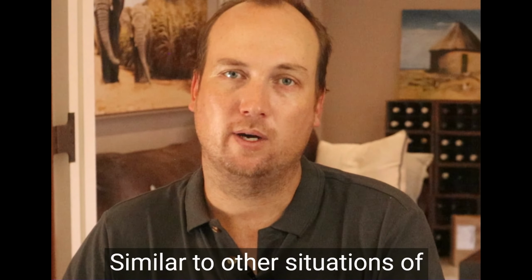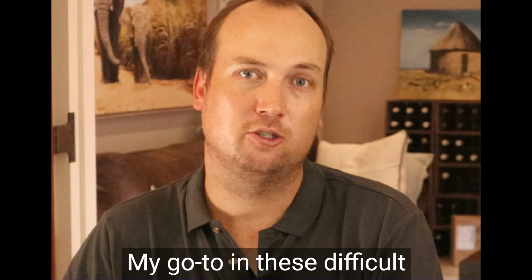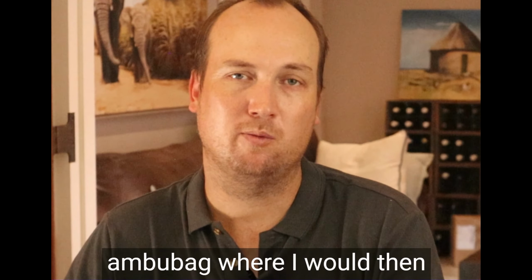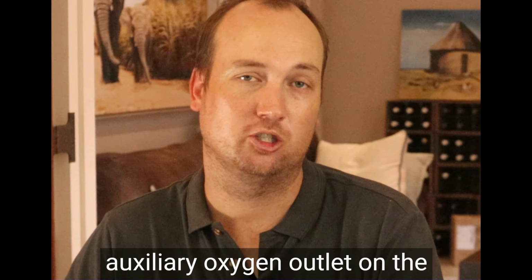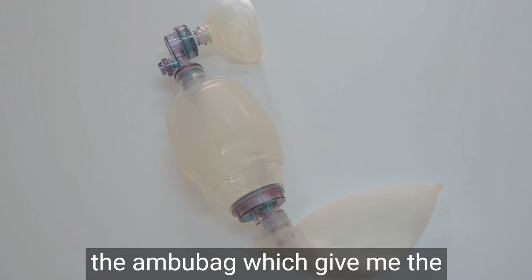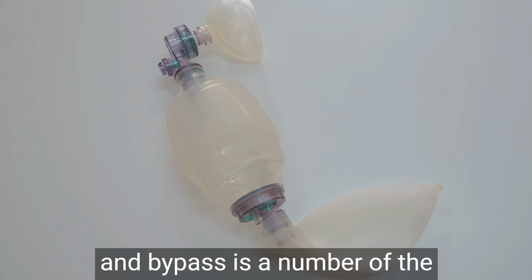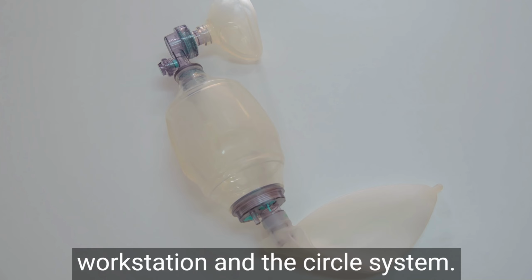Similar to other situations of ventilatory problems in theatre, my go-to in these difficult situations is often the emergency ambubag, where I would then connect the ambubag to the auxiliary oxygen outlet on the anesthetic workstation, and then ventilate the patient using the ambubag, which gives me the most control over the ventilation and bypasses a number of the complexities of the anesthetic workstation and the circle system.